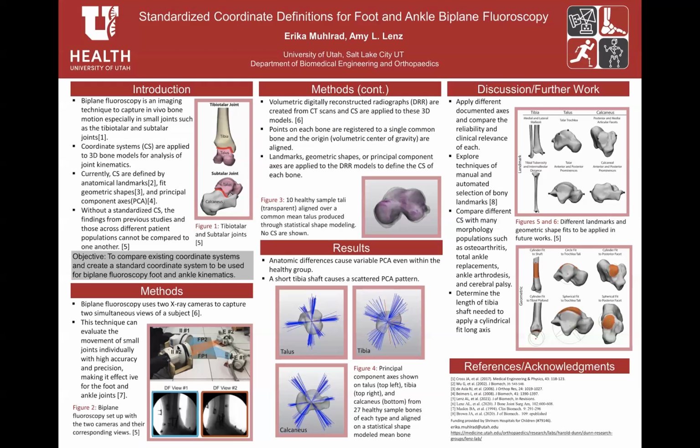Other than principal component axes, in the future, we'll compare axes generated from various bony landmarks and geometric shapes fit to the bone. Finally, we want to determine a standard and meaningful coordinate system to be used across the field of foot and ankle biomechanics biplane fluoroscopy studies.